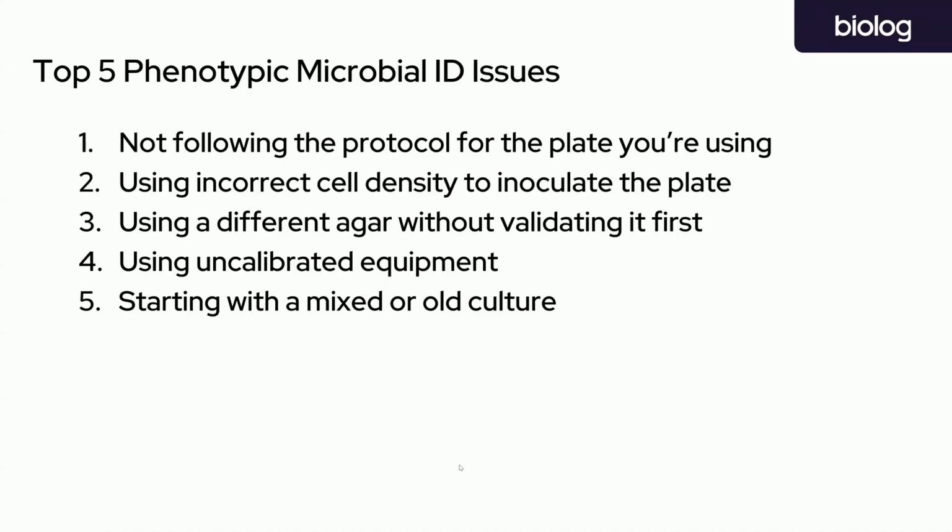And I'm assuming that can mean a pipette, even a multi-channel pipette, or the turbidimeter, or anything that you're using that's going to introduce errors. Yeah, especially when it comes to how much volume you're pipetting into each well.